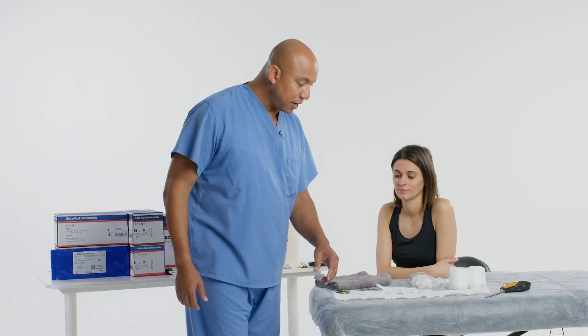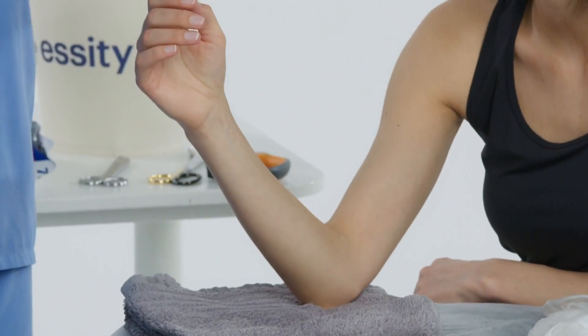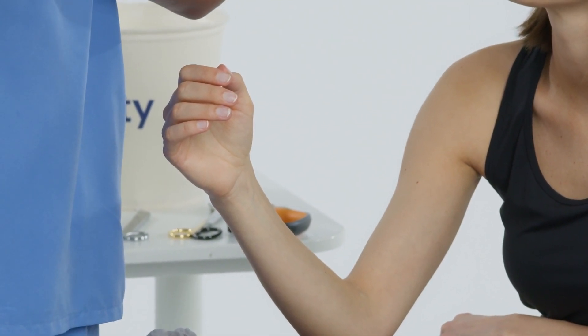Let's apply this to the patient. The patient's injury is on the second and third metacarpal, possibly a second or third metacarpal fracture. We're going to position the patient with their wrist in 15 to 30 degrees of extension and the metacarpophalangeal joint at 45 to 90 degrees of flexion.